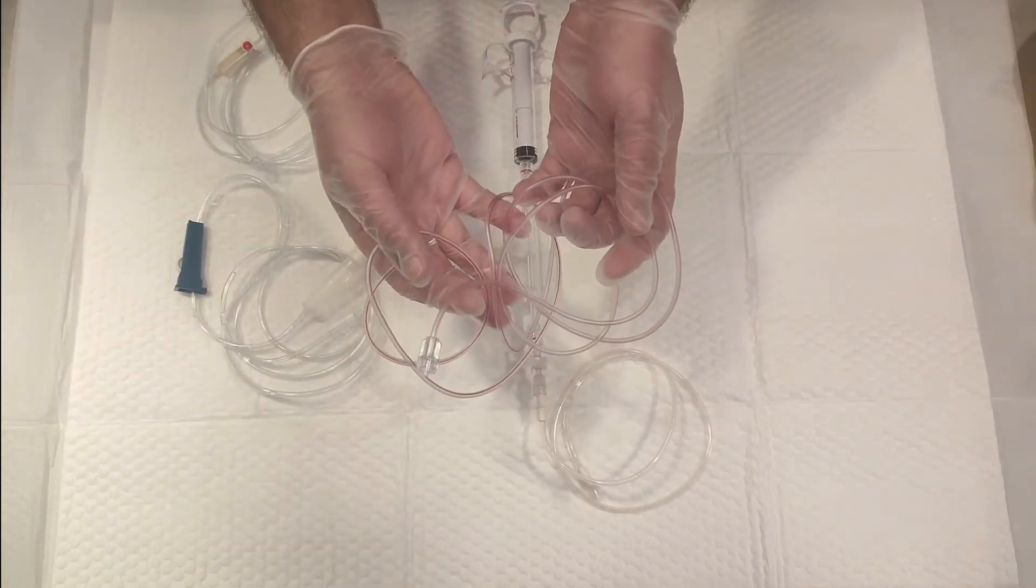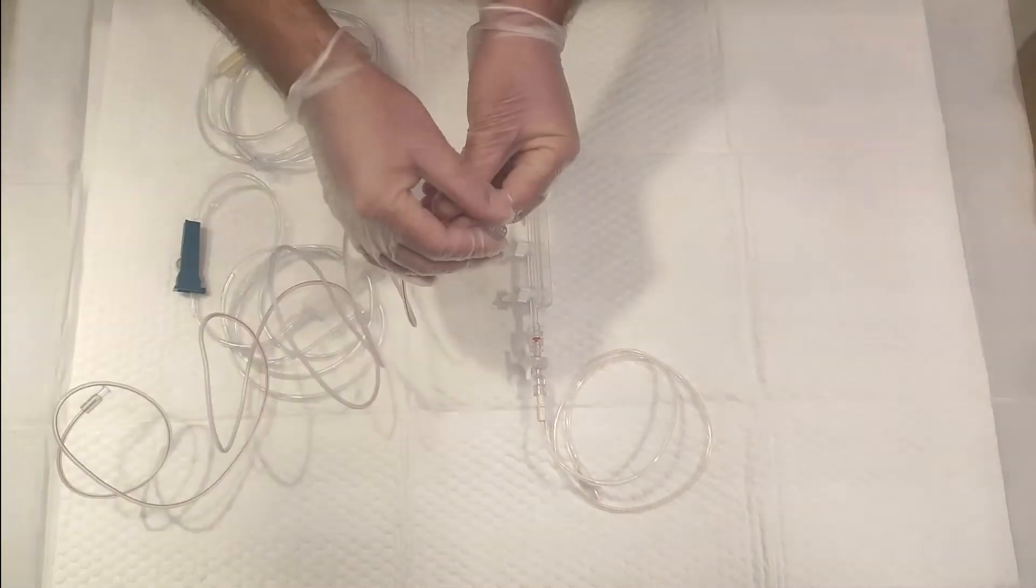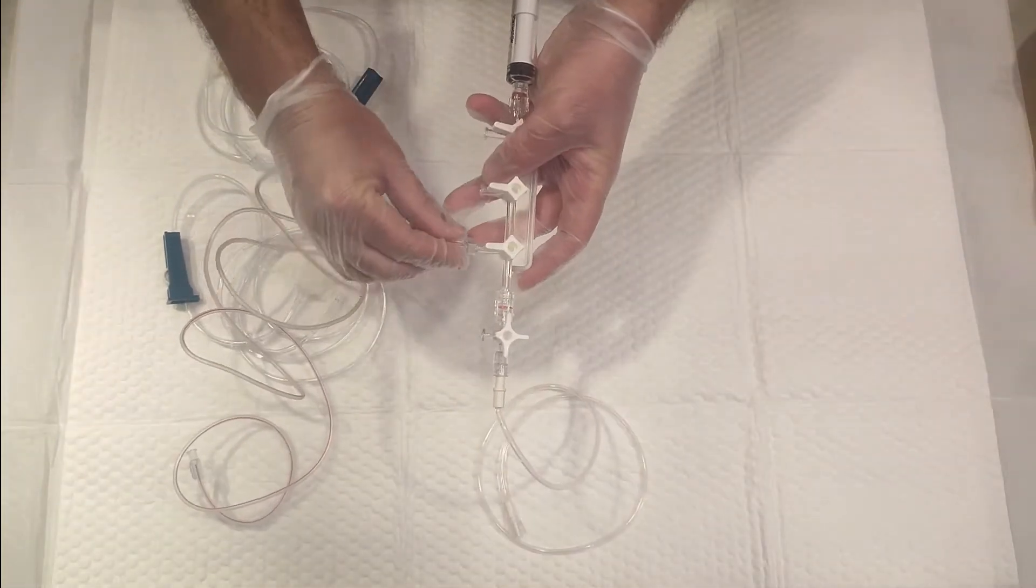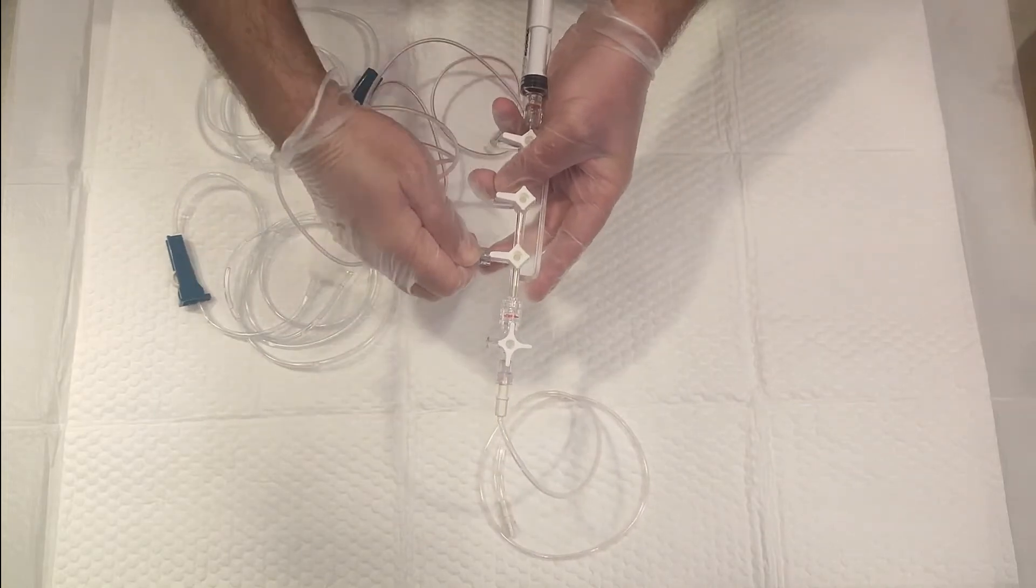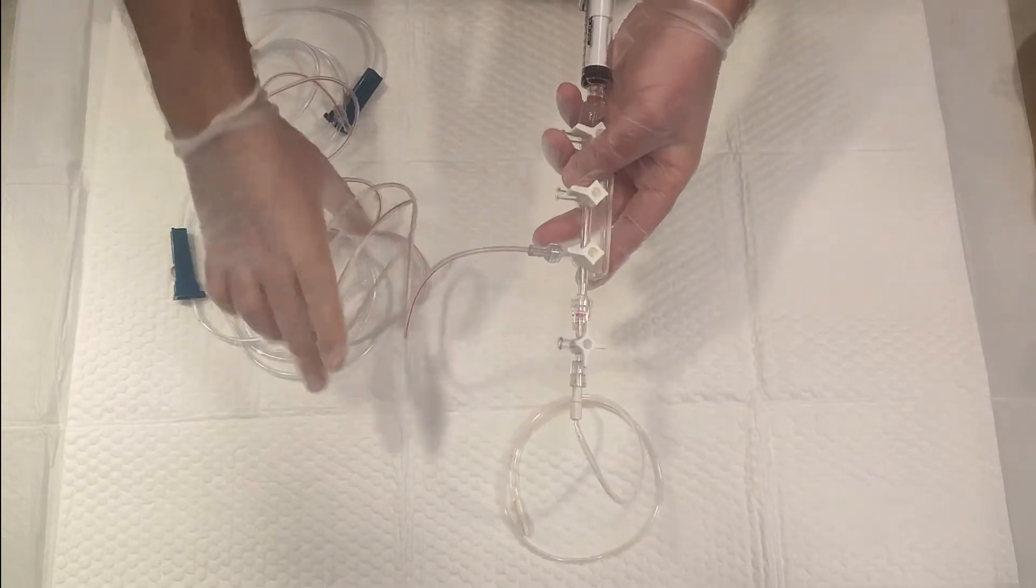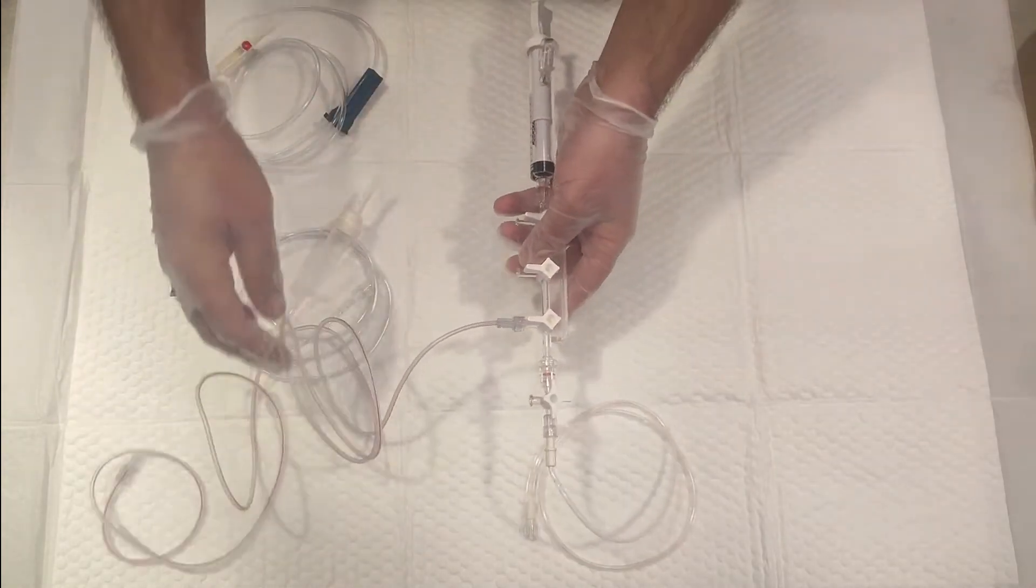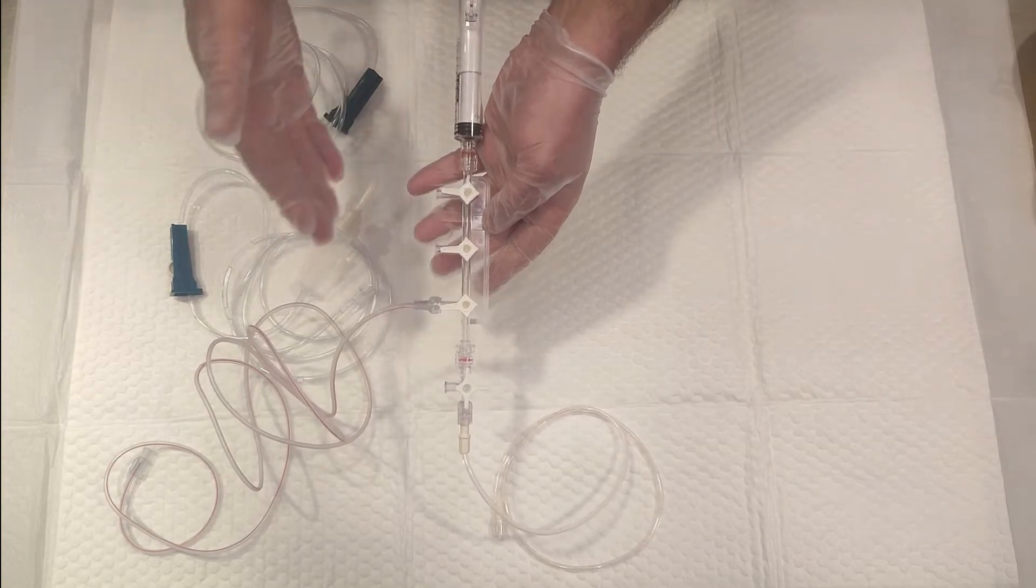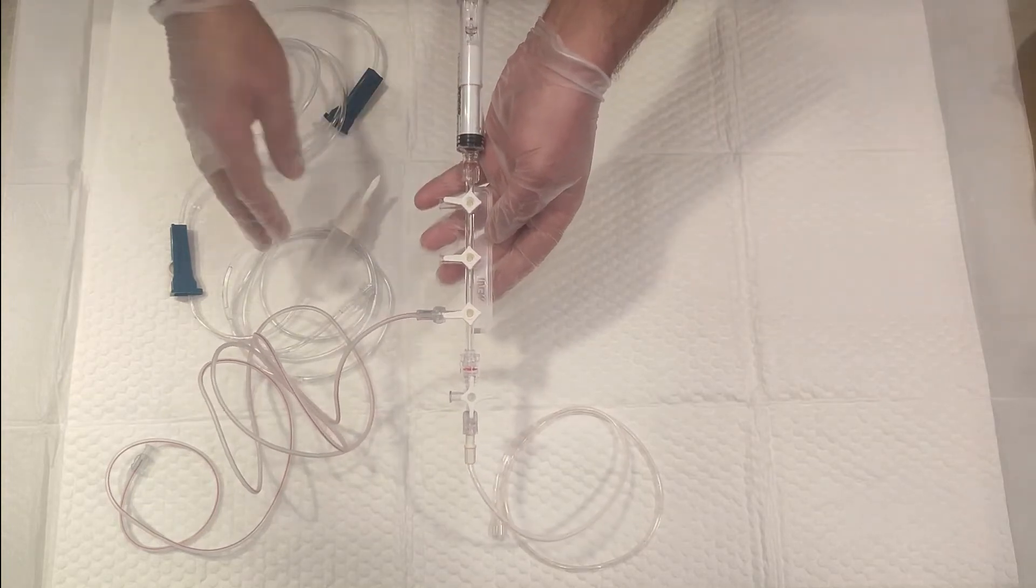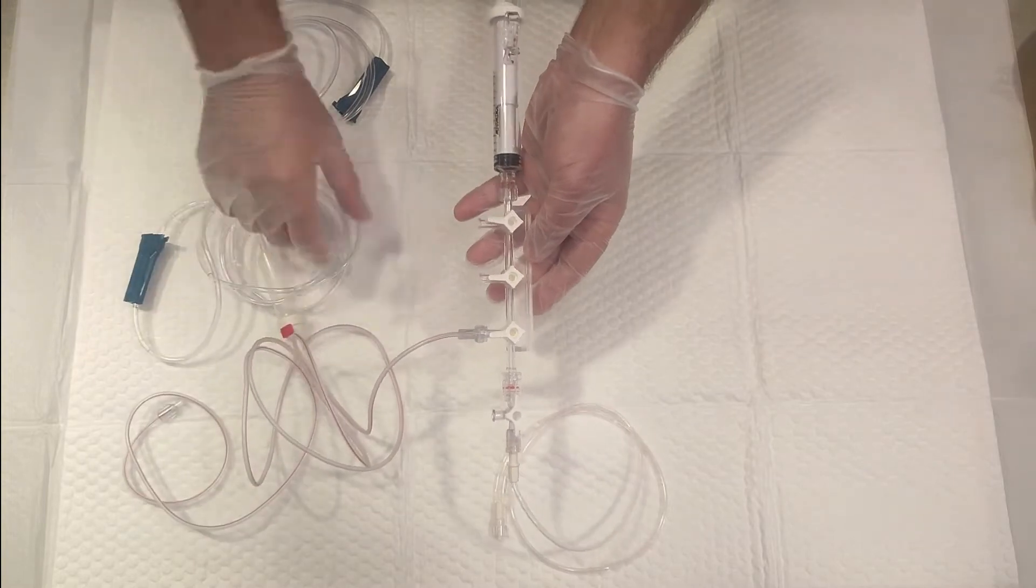The pressure monitoring line can be connected here. As you can see, rotate it clockwise, lock and tighten it. Keep it aside for a while. In some cath packs, it comes already attached, but in some packs, it comes separately. It's easy to connect.